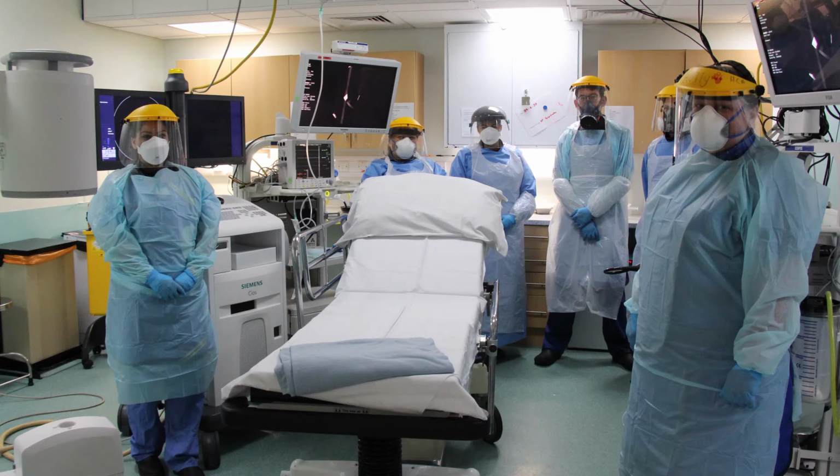On the day of the procedure, you will be greeted at the endoscopy reception area. You will meet one of our admitting nurses. They will ask you some simple basic questions about your general health. You have also been asked to fast for 6 hours prior to the procedure. The doctor who will do the procedure will go through your consent with you to explain the benefits of having this procedure done, as well as the small risks that occur with any endoscopic procedure. You will then wait in the waiting room prior to entering the endoscopy room.